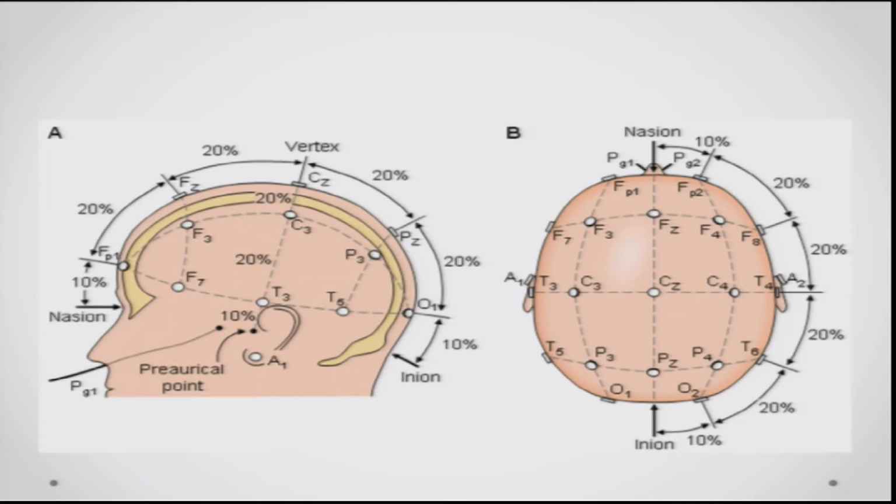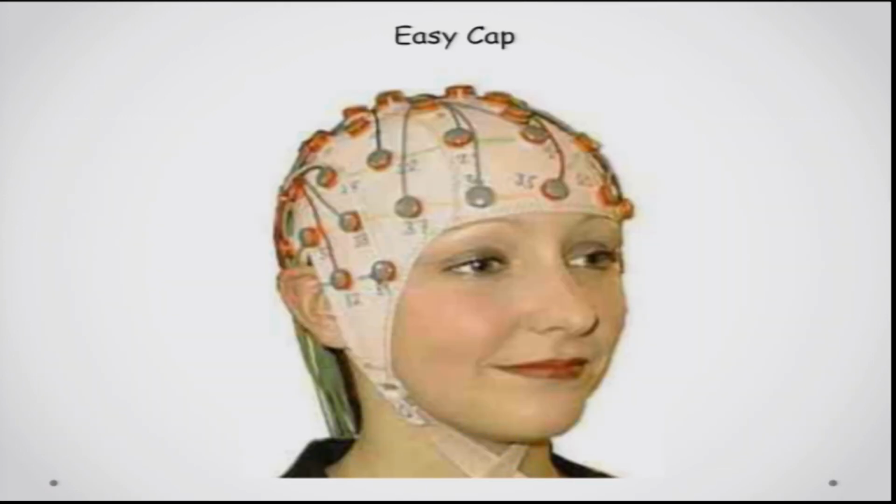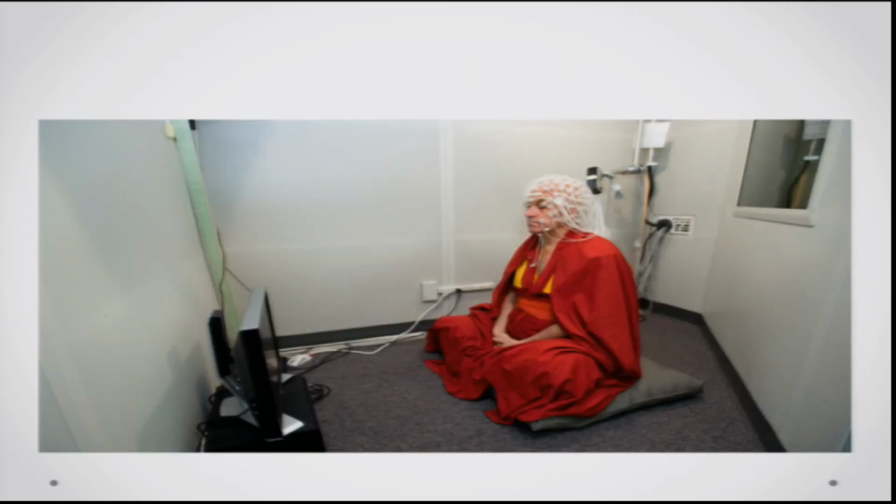Now, we have more advanced EEG machines which use 128 or 256 geodesic channels, which closely fit the head like a volume conductor, and we take the whole volume of the brain and try to cover it more closely in a dense electrode package. These are caps which are just put on the head, otherwise you have to put a pasting gel between the electrode and the scalp after cleaning it thoroughly.